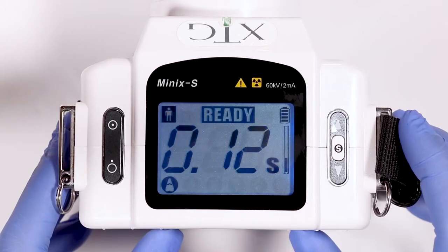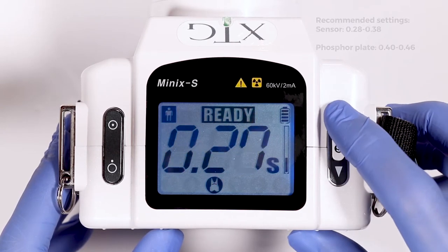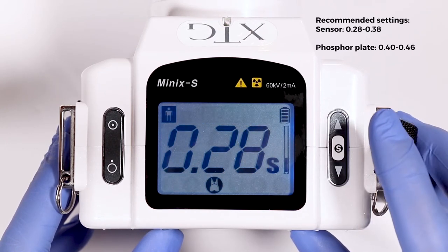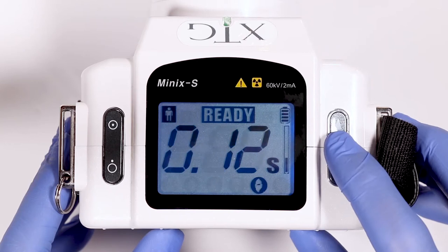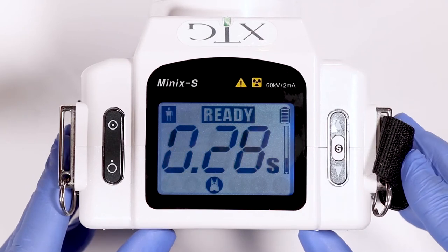The XTG settings. Press the S button to scroll through the different tooth types. The up and down arrow will change the exposure time for each tooth setting. Press the S button for 2 seconds, then press the S button again, and the new exposure time will save. Notice as we go back to the molar setting, it is now saved to 0.28.